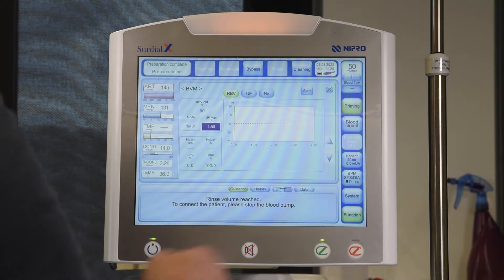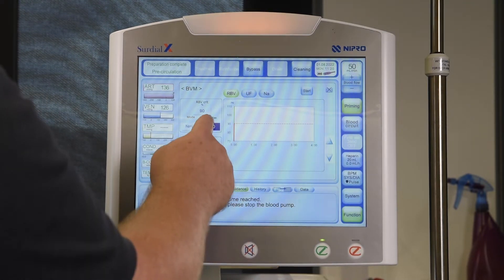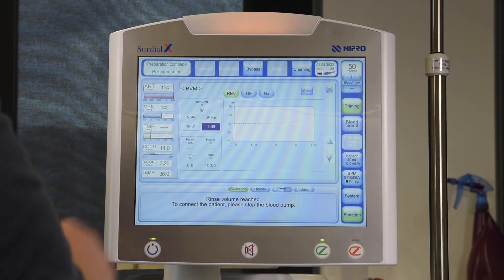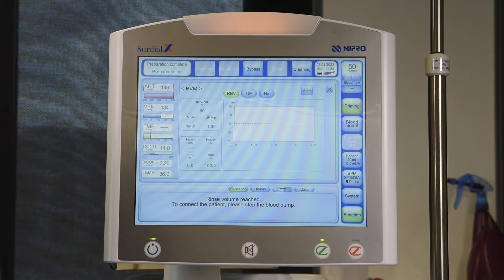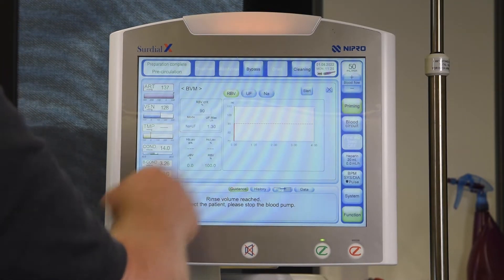To set the maximum UF rate, highlight the number. Use the arrow keys appearing on the right to change it. To confirm, touch the number again.